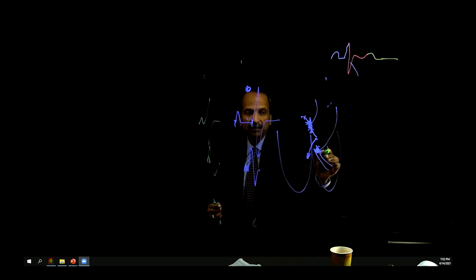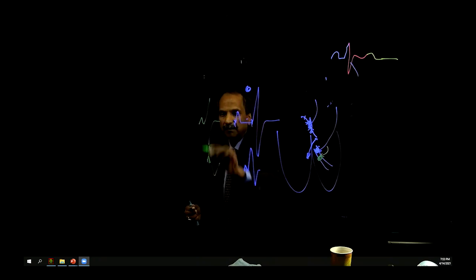That tells you you need to go even more downstream. And eventually, at some spot, you're going to have a match of the conduction interval with the arrhythmia interval at that site. Now, does that tell you where we need to ablate?